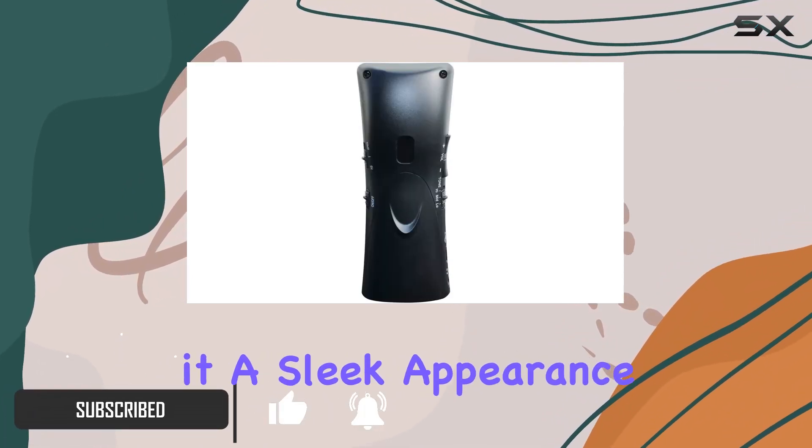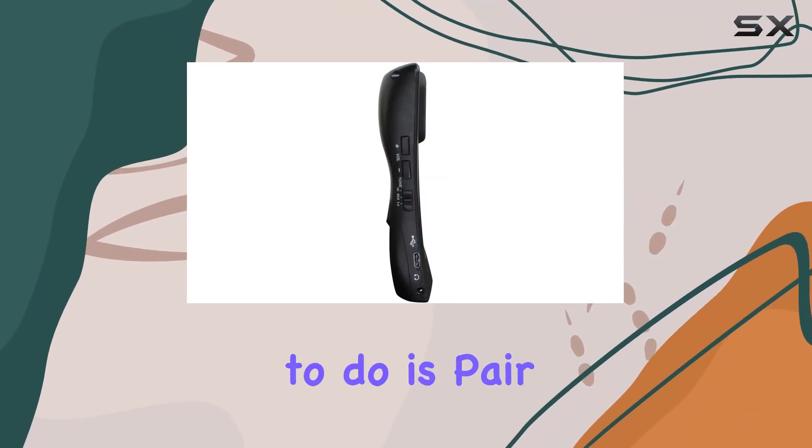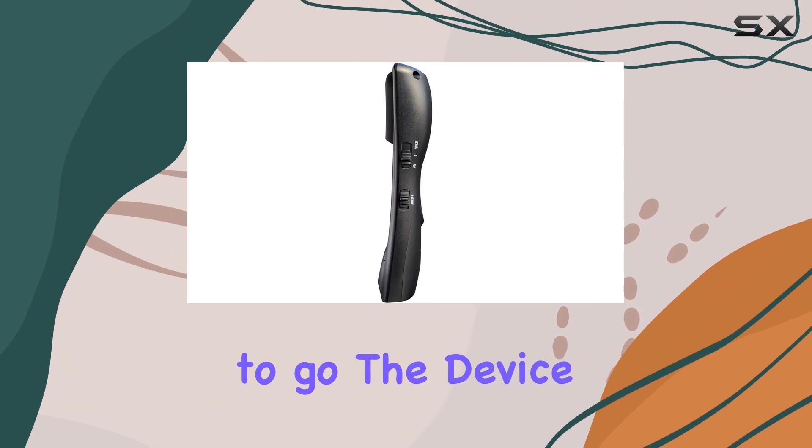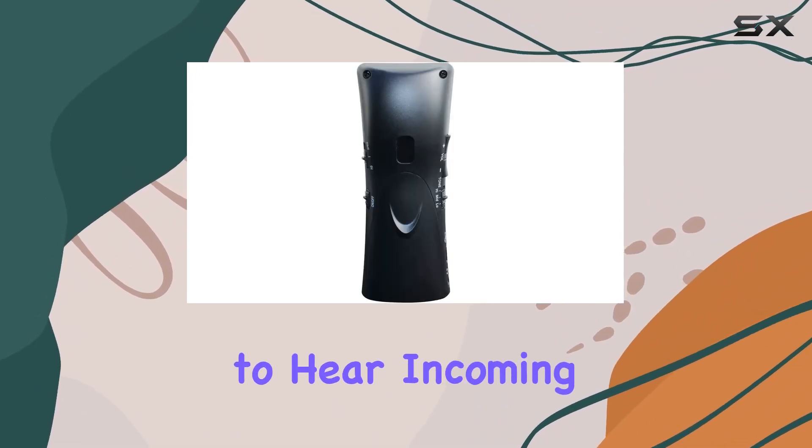The gray color gives it a sleek appearance. First off, the setup is a breeze — all you need to do is pair it with your smartphone, and you're good to go. The device serves as a handset, eliminating the need to strain and struggle to hear incoming calls.